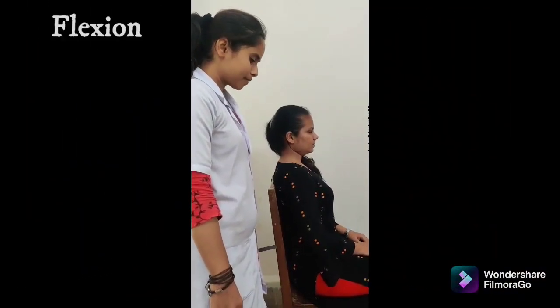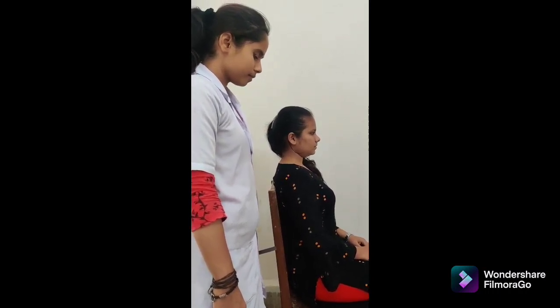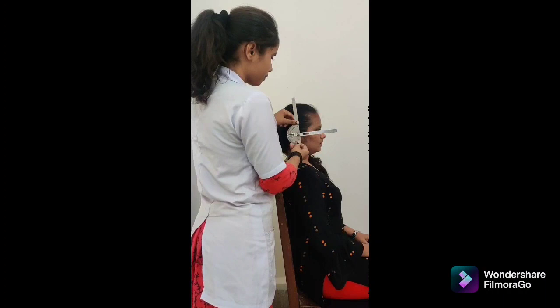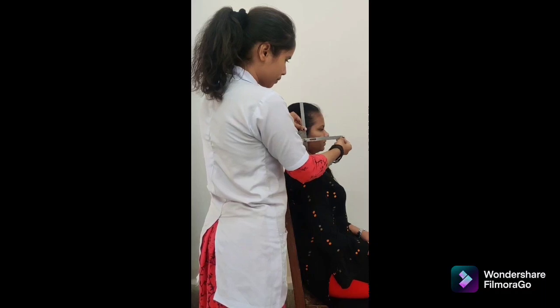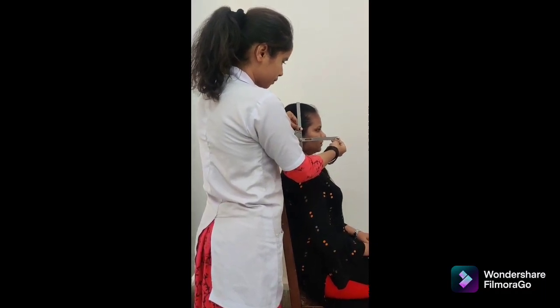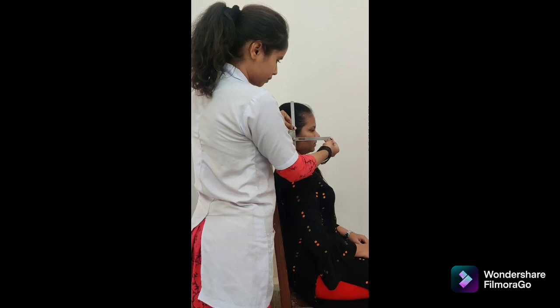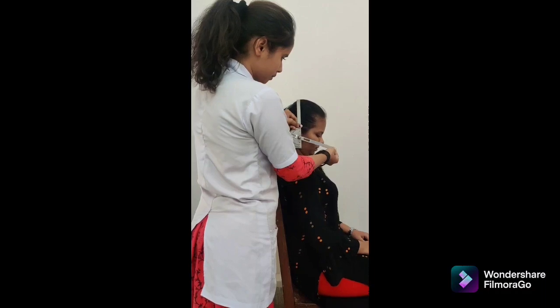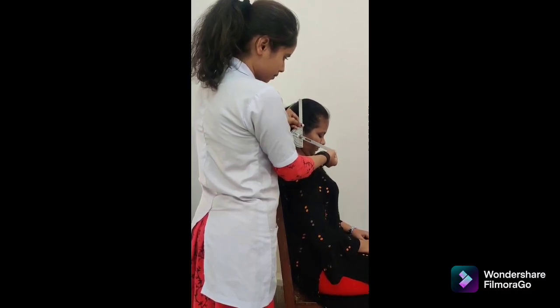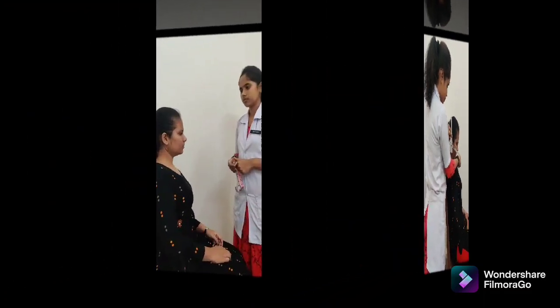We are going to perform cervical flexion with universal goniometer. Patient position: high seating with thoracic and lumbar spine supported by back of chair. Goniometer alignment: fulcrum over the external auditory meatus, stable arm perpendicular to the ground, movable arm parallel to the tip of nose. As the patient bends the head, the movable arm moves with the movement. Normal range of motion is 0 to 45 degrees. Instruction to the patient: bend the head forward and downwards while keeping the trunk straight.